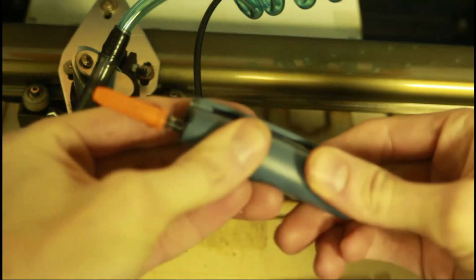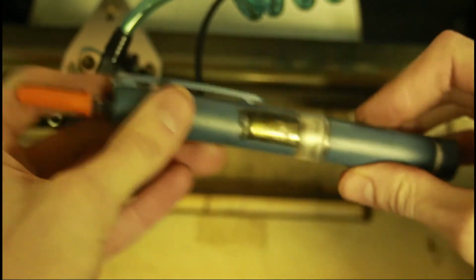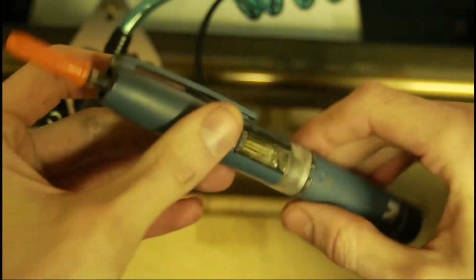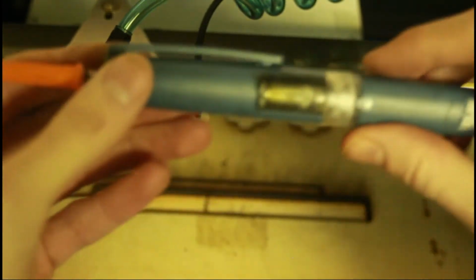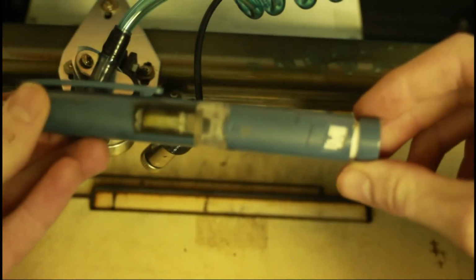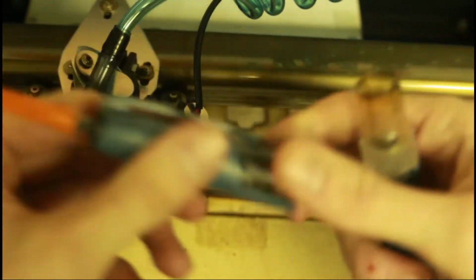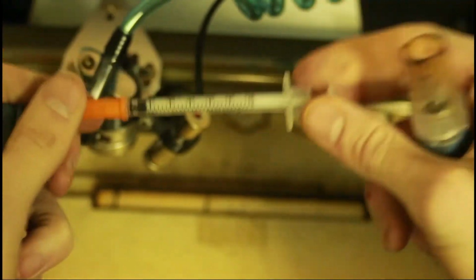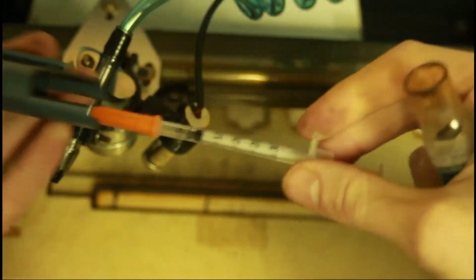So what we're going to do is we're going to put the cap in like so. Put it in through there, nice and tight all the way up, and then we're going to put this in like that until it just simply gets in. And boom, look at that solid fit. That is a beauty right there. Let's test it out while we're at it. Why not? All right, so let's take this up to 6 units, or about 7 units. Put it back in.